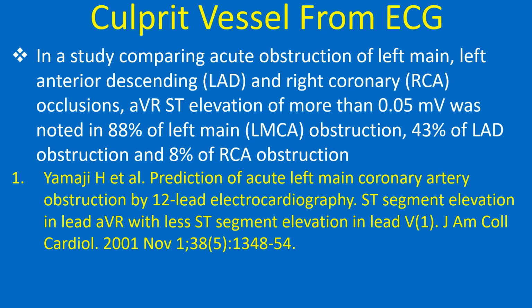In a study comparing acute obstruction of left main, left anterior descending and right coronary occlusions, AVR ST elevation of more than 0.05 millivolts was noted in 88% of LMCA obstruction, 43% of LAD obstruction and 8% of RCA obstruction.